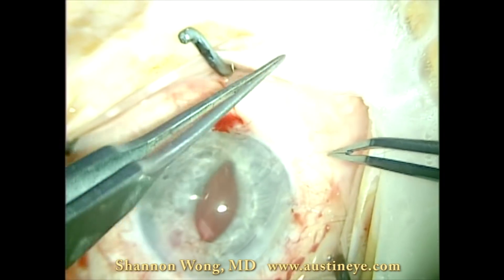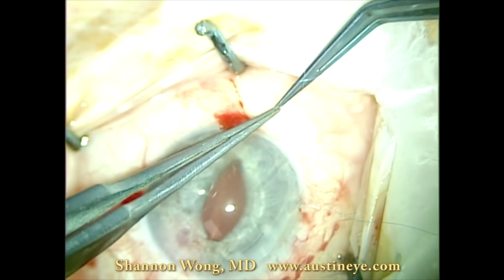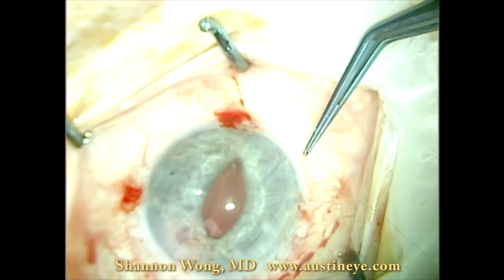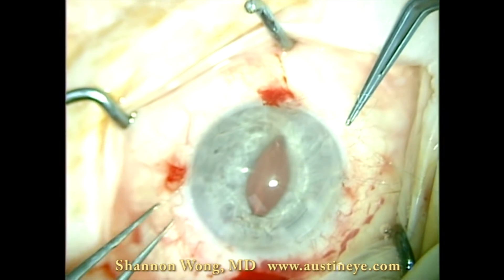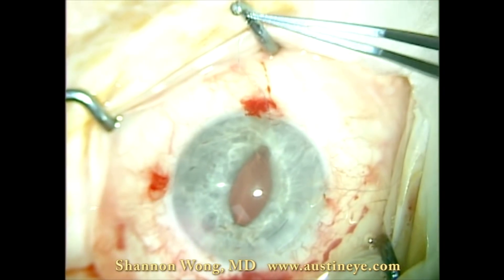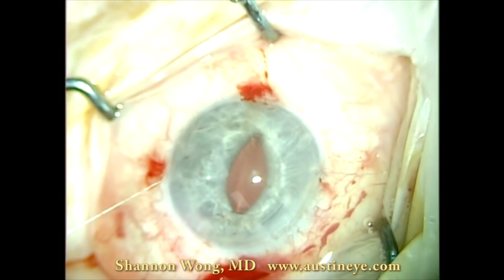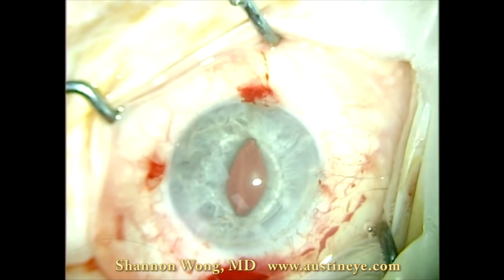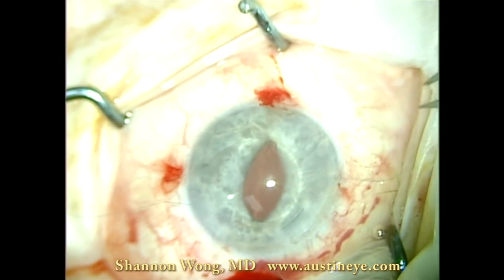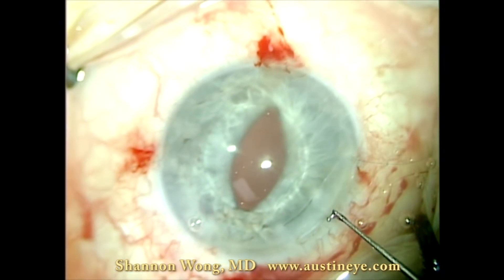We're essentially creating a knot externally and then pulling it internally. The moment of truth is when you pull the opposite end of the suture — the knot moves inside the eye and comes into position to secure the haptic. We do the same thing on the opposite side: we exteriorize a loop from the suture on the left side, bring it out the right side, do three throws, then pull the left side, and the knot goes from the outside to the inside and secures the haptic. Once we've secured the haptic on each side, we proceed with pushing the optic into the sulcus posterior to the iris plane.